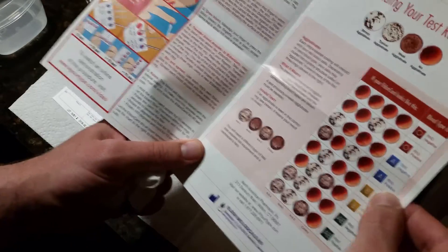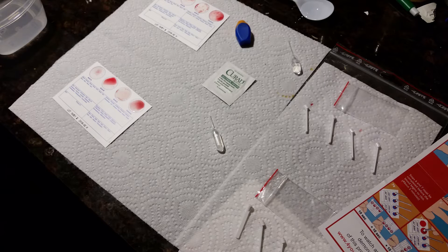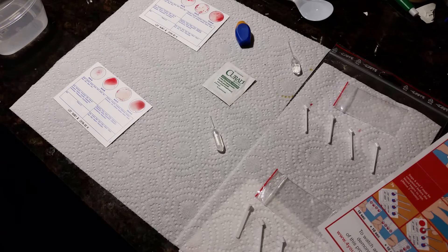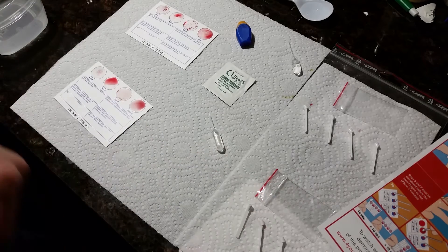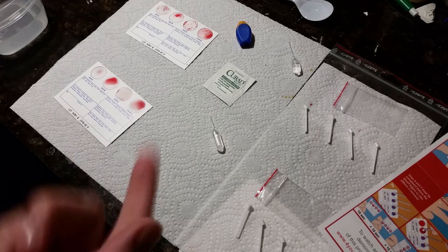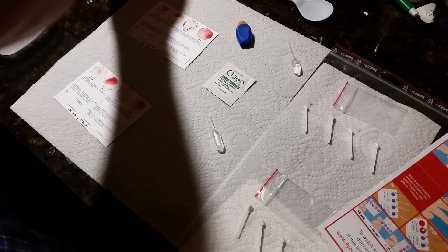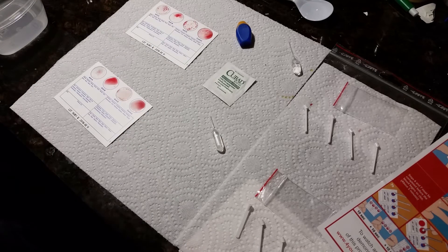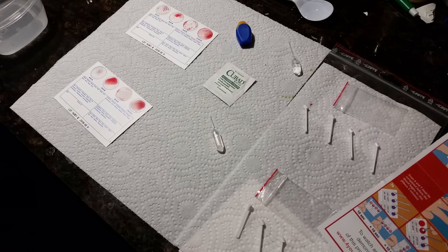So that's my blood group type. I'm going to record that and email that information to myself so I never lose it. When you know your blood type you're able to do things like get an emergency medical bracelet or dog tags — so in a car accident or in a foreign country, they know what blood type you are.